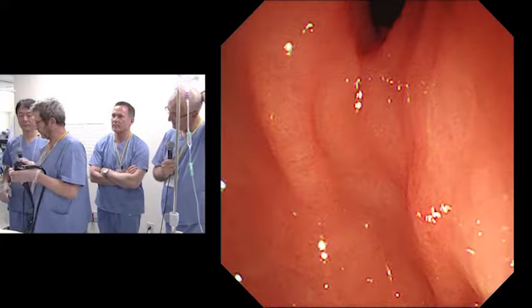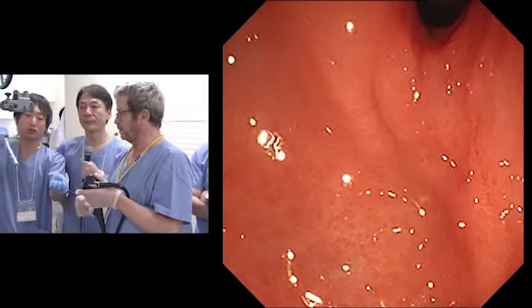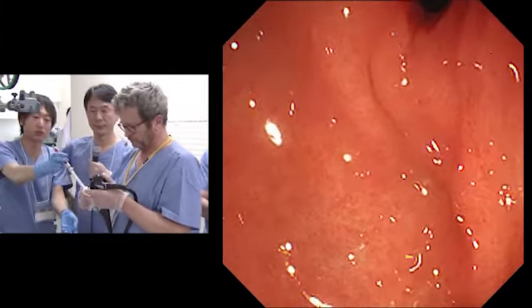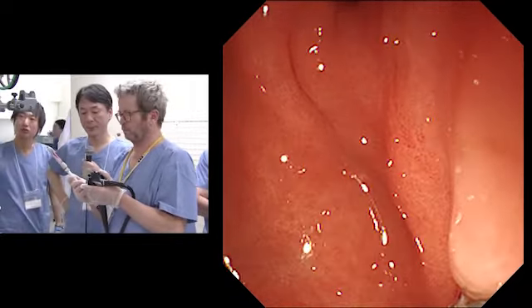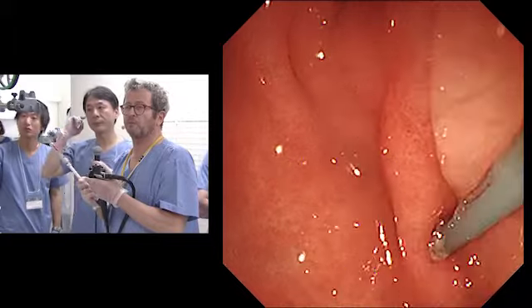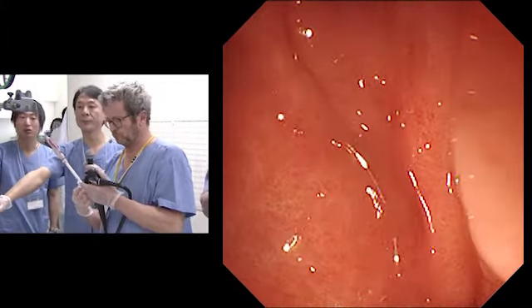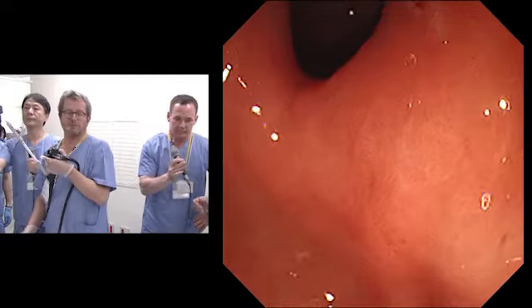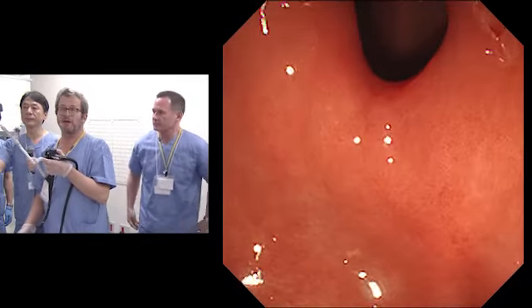So I prefer to position the needle now, because we are now straight, so we have a better chance to be in a good position. Thierry, are you doing FNB on all solid lesions, or do you see any role for an FNA in solid masses at all at this point? No, I think now it has been demonstrated that FNB has a higher accuracy than FNA.